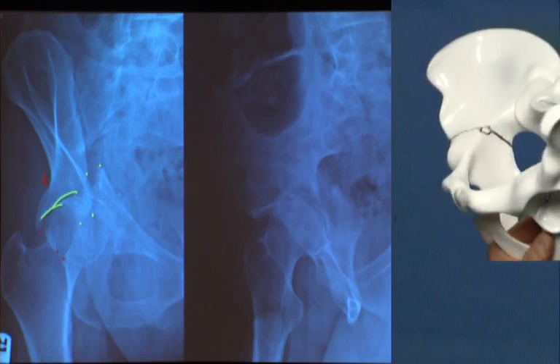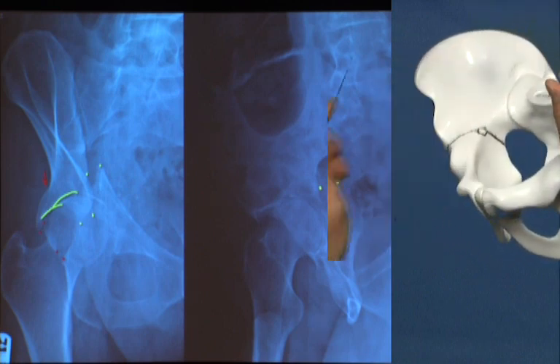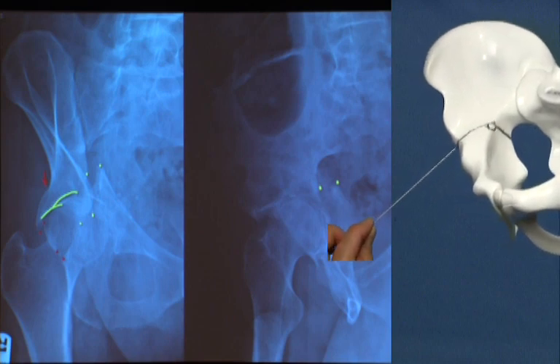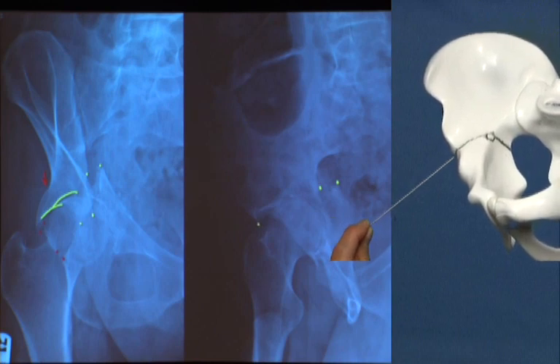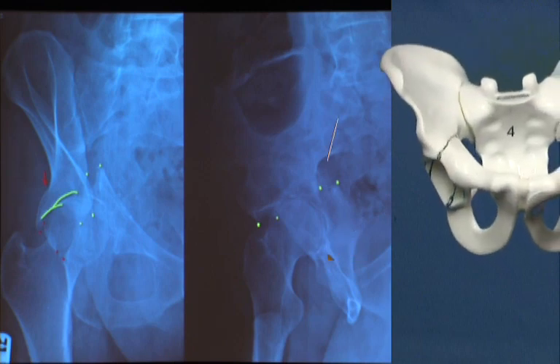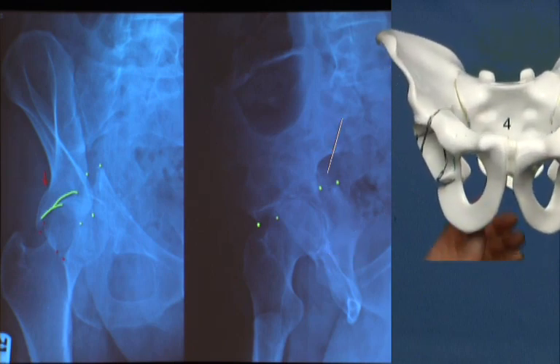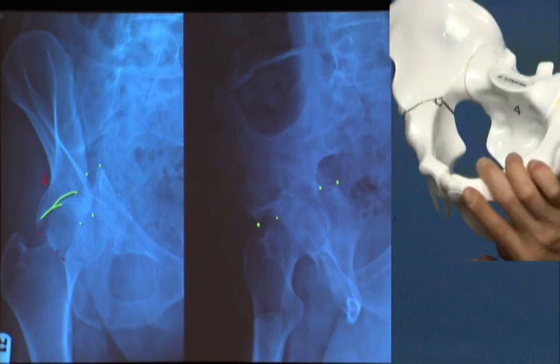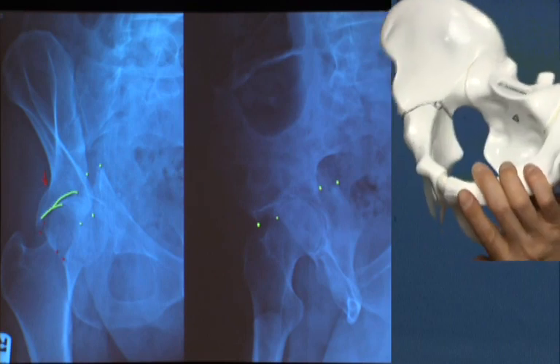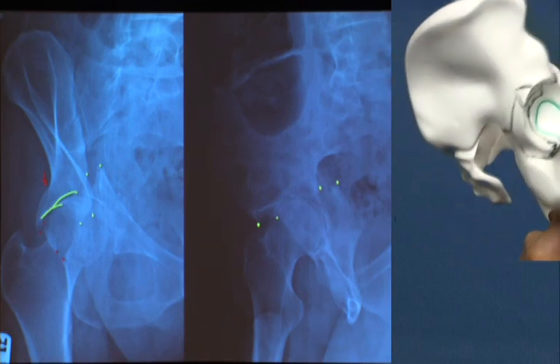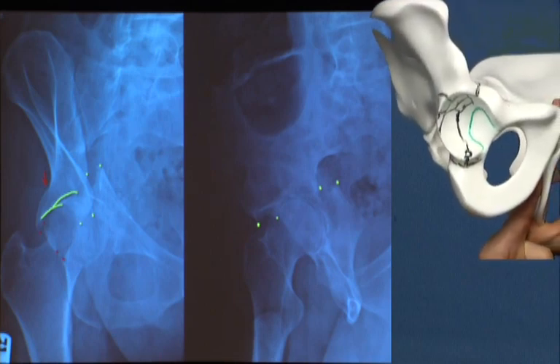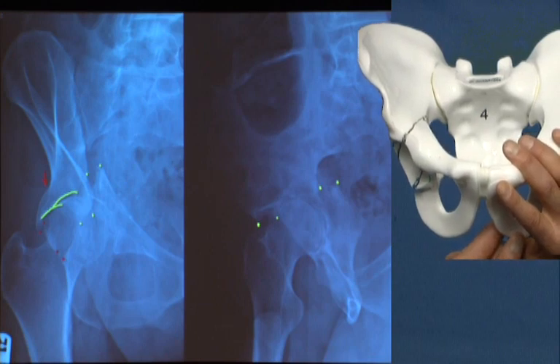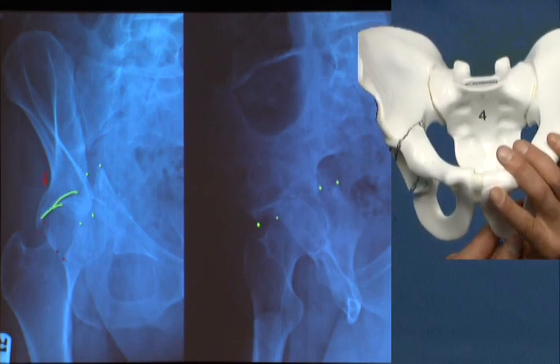Again, looking at where our impaction is: this is intact roof of the acetabulum, this is the area of the impaction sitting more medial and posterior to it, and the femoral head is following that, with the displaced portion of the roof on the lower portion of the acetabulum. The iliac oblique view looks like a very simple almost horizontal fracture pattern — exactly what we see here on the dry bone we've drawn — with major displacement occurring only very high on the anterior rim. I'm comfortable now that the data from the CT scan hasn't changed my drawing and that I have an accurate representation of the fracture pattern. This represents a complex transverse plus posterior wall fracture with a multifragmentary posterior wall and articular impaction of the roof of the acetabulum — termed a transtectal fracture — so: transtectal transverse with multifragmentary posterior wall.